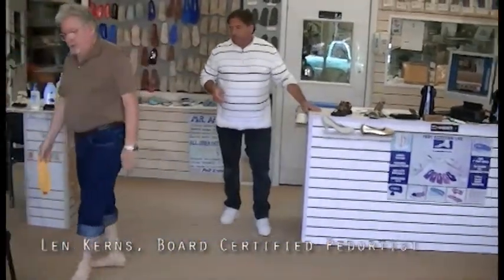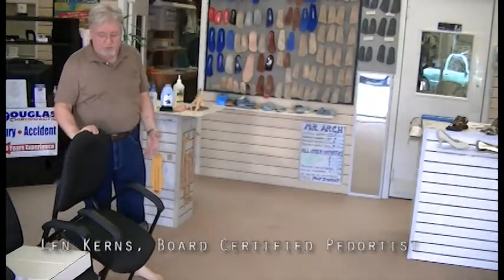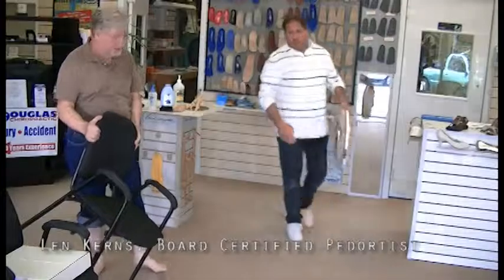Now we're going to try to show you how to cast the foot in the office. I've taken 2 casts on my casting table, which was a lot easier for the cameraman to show you. And Mark now is going to demonstrate how to cast my foot in neutral, which is the way you'd be doing it in the office, where the patient's sitting in a chair.